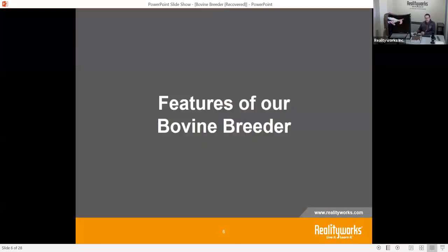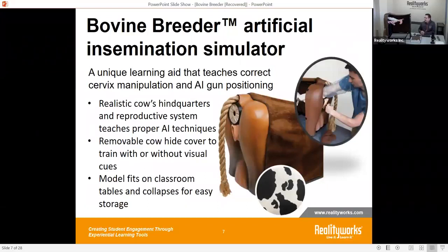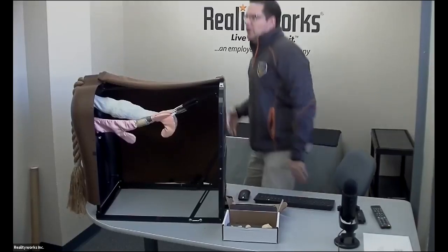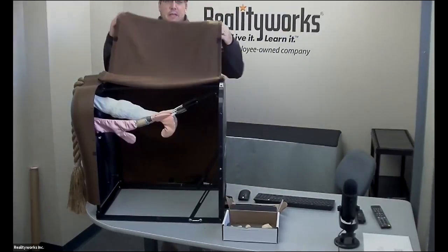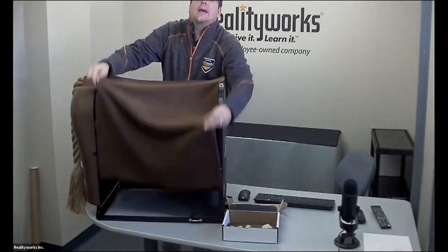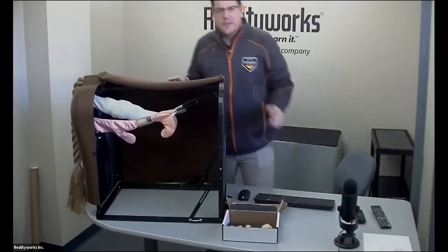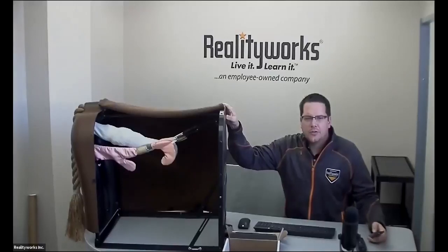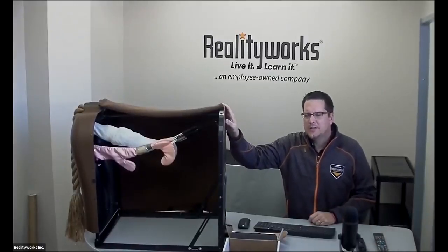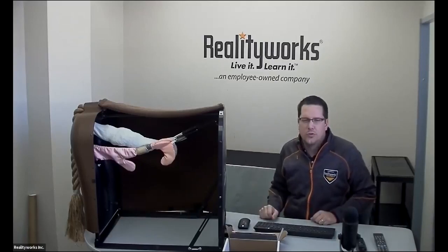We're going to talk about the features of the bovine breeder. We have a very unique and helpful tool here, and we're going to hear from a teacher who is using it. The bovine breeder is a realistic hindquarters and reproductive system of a cow, designed to show students an understanding of the product. It features a hindquarters with a removable hide so you can see inside the reproductive tract and the digestive system. It is collapsible, fits on a table or desk, and allows you to move it from classroom to classroom.